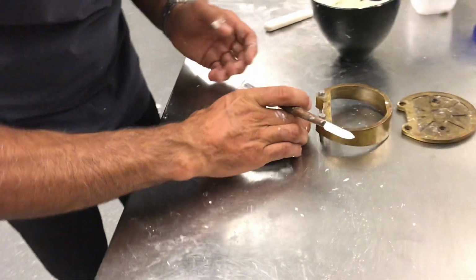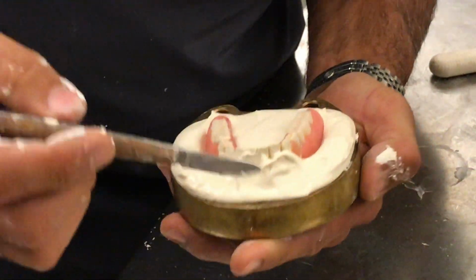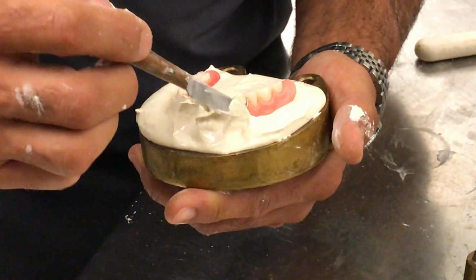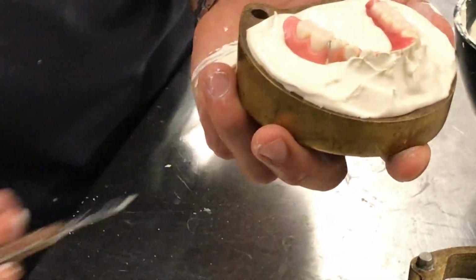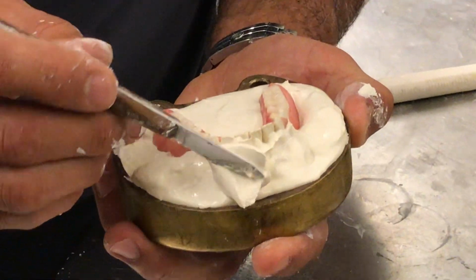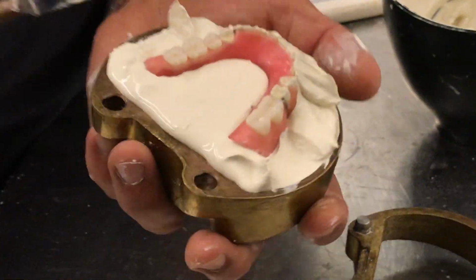I'm going to pick up my flask now very carefully, and now start moving the stone plaster mix around to make sure that we block out all the undercuts and certainly not create any. Just gently vibrate it. I have more than enough that I need right here. I'm going to take a little bit from here, which is excessive, and bring it over here. Kind of move it around. Take a little bit from here. I can certainly go back into my bowl and pick some up, but I have more than I need right here.